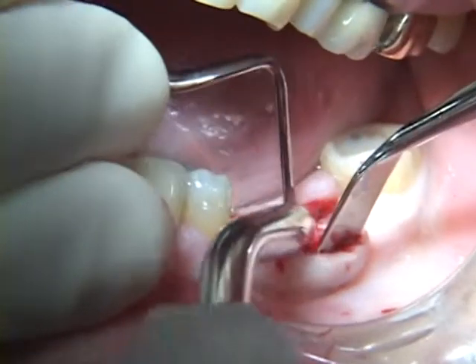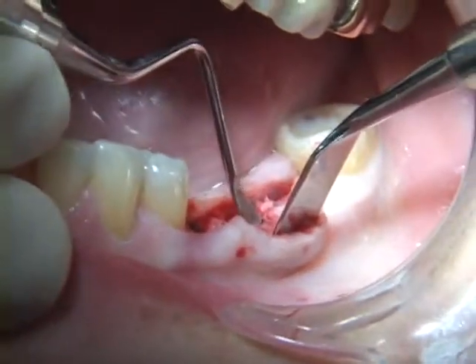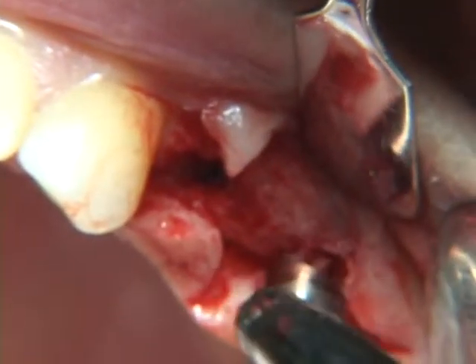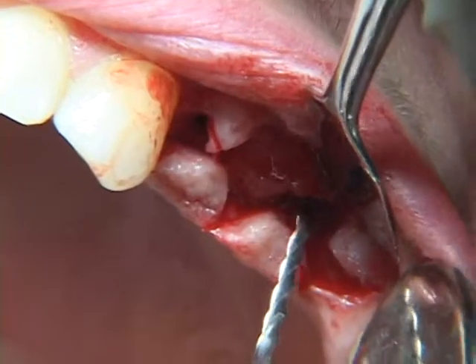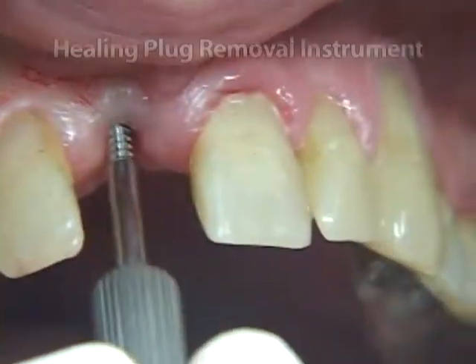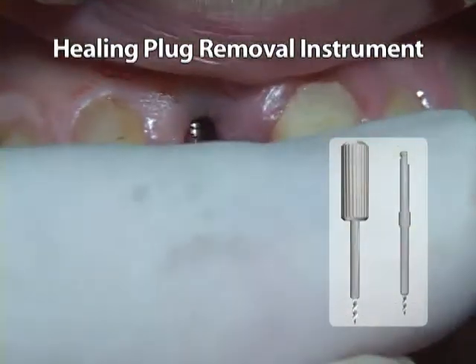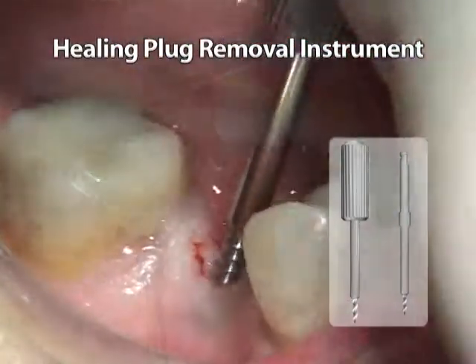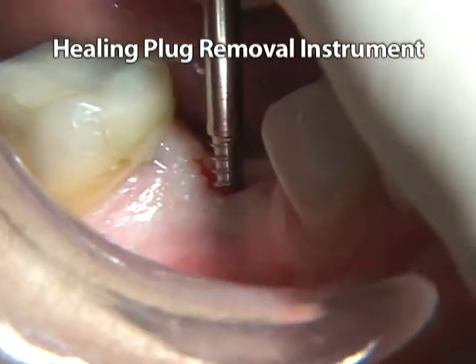After locating the black healing plug, complete removal of any overlying bone or soft tissue with a curette, sulcus reamer, rongeur, or round burr is essential to facilitate the removal of the healing plug by twisting a healing plug remover or number 110 root canal reamer into its center hole before removing it manually with a twisting and pulling motion.